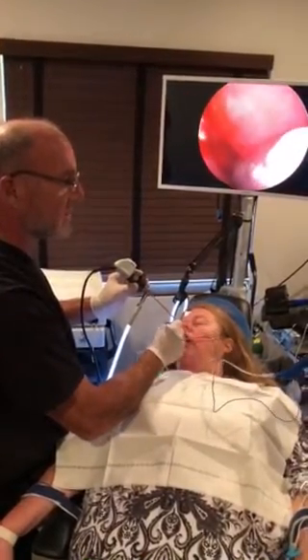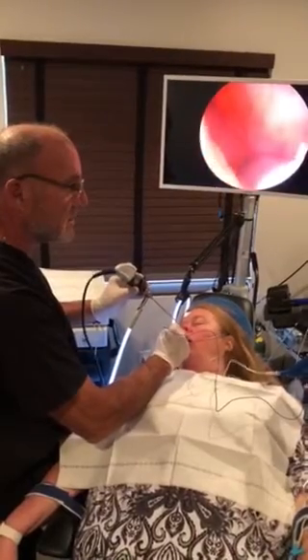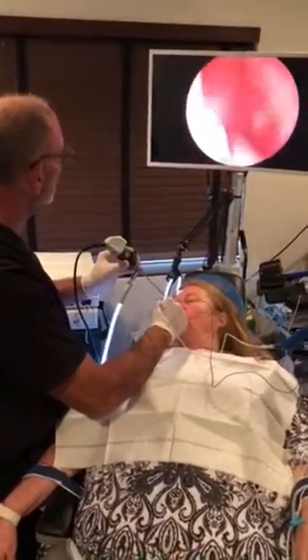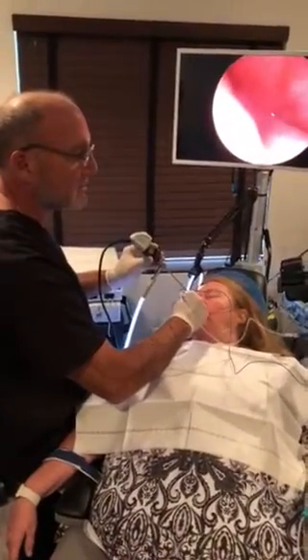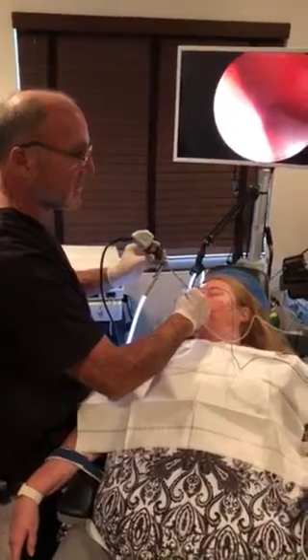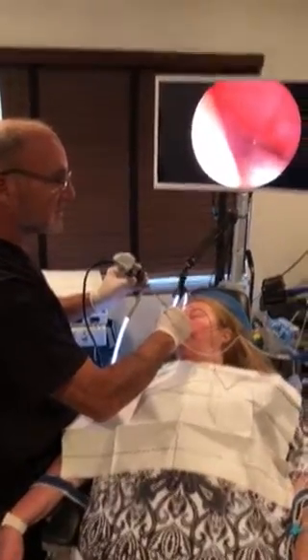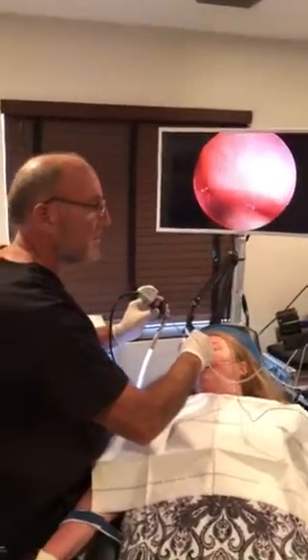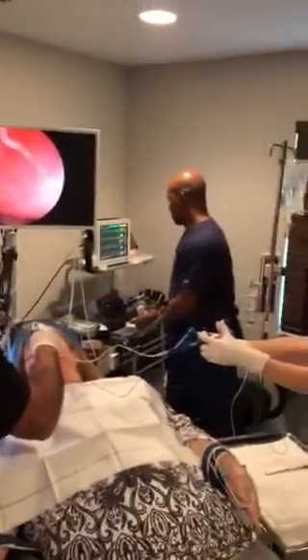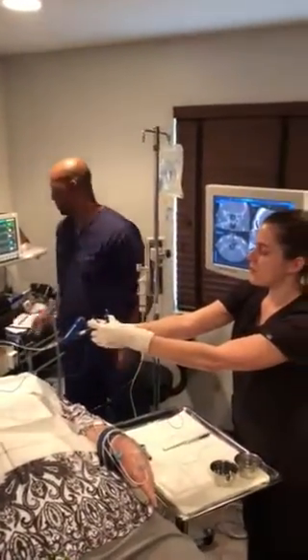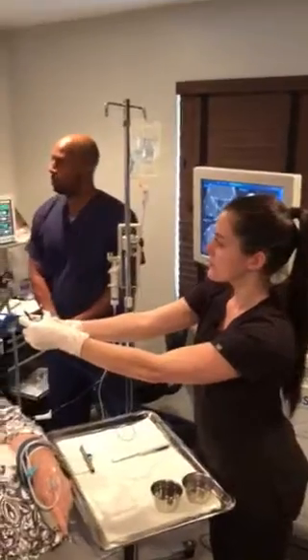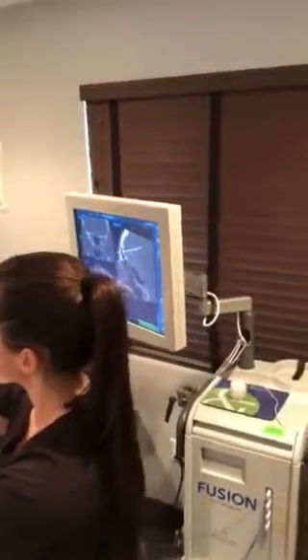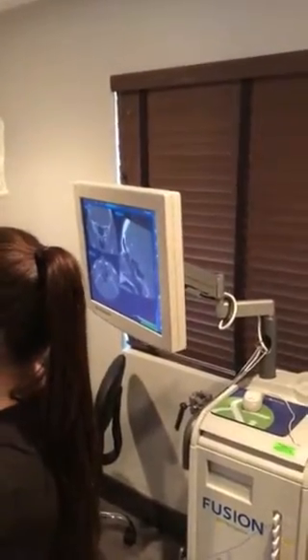Same thing on this side. Inflate. Inflated. Inflate. Again, correlating this to be in the sphenoid sinus on a CAT scan is very helpful. Deflate. Inflate. Inflate. See how we're in that right sphenoid there? Deflate. Deflated. Very good.